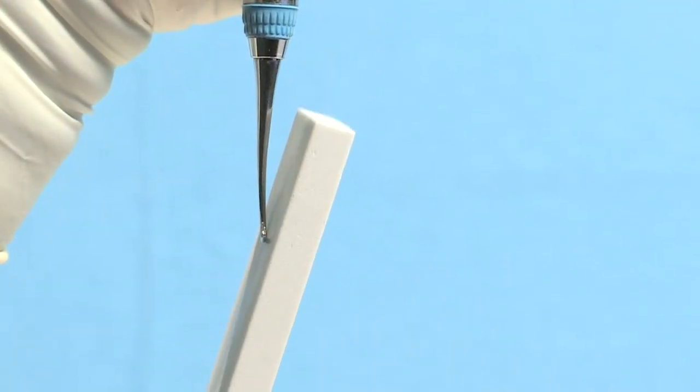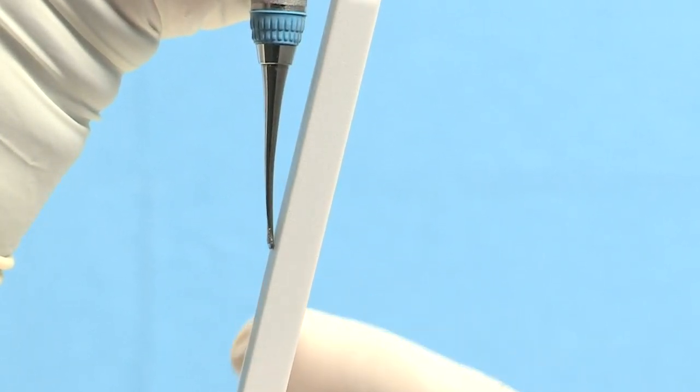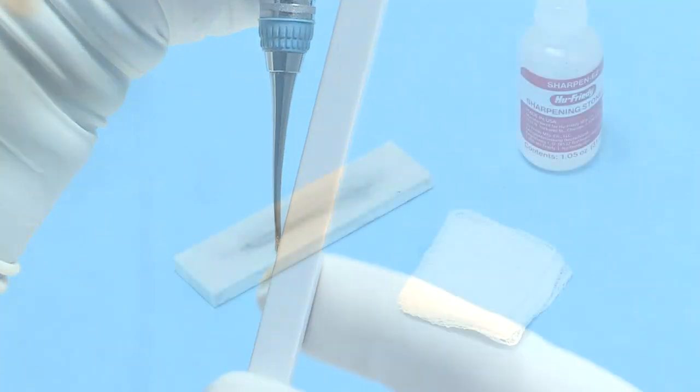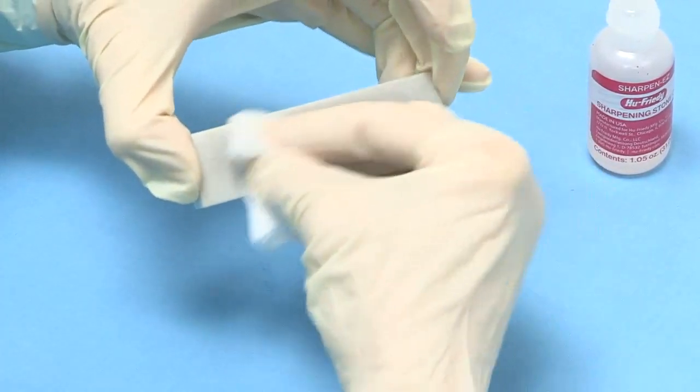Repeat the sharpening process starting at the heel third of the blade and progressing to the middle third and finally to the tip third of the blade. At this time, you may also want to use gauze to wipe the metal filings from the stone.